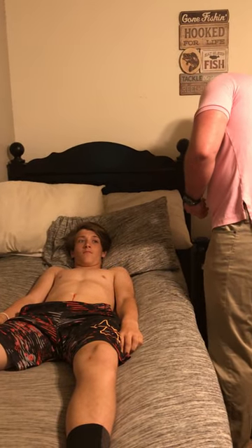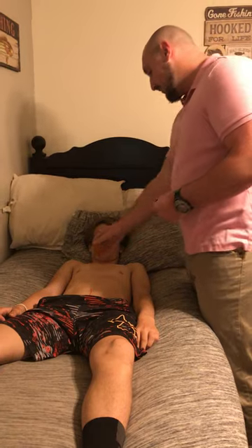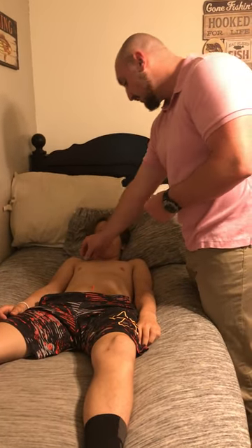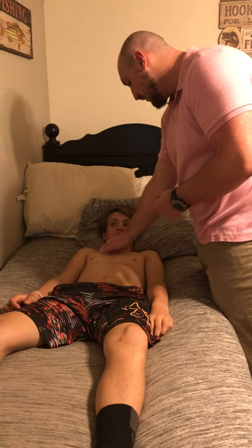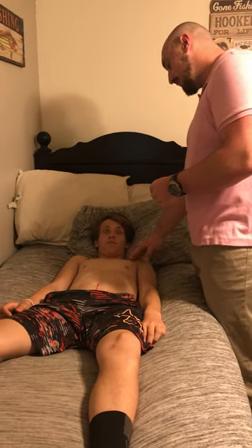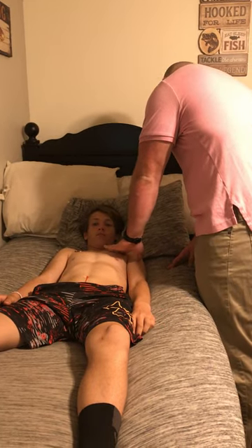So Matthew, we're going to start out with R1. R1 is going to go into your right infraclavicular fossa, right there. And your left arm is going to go into your left infraclavicular fossa, right there.